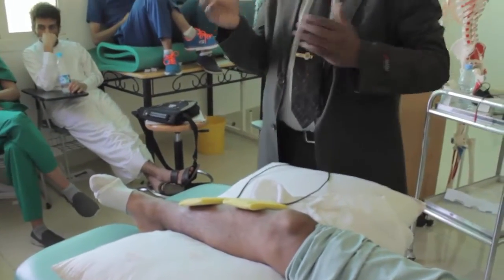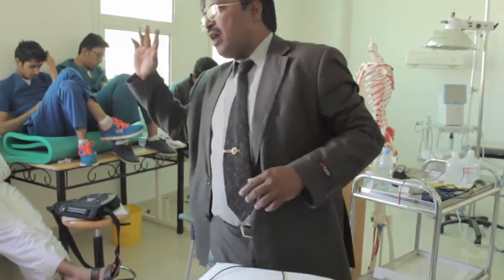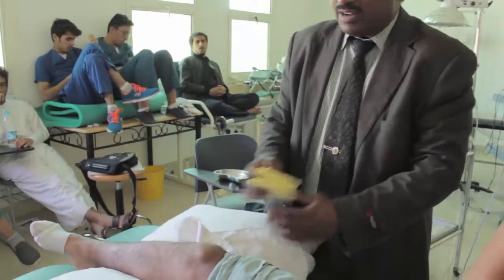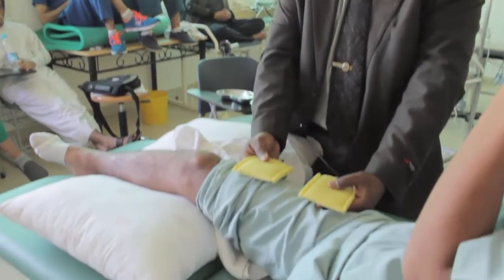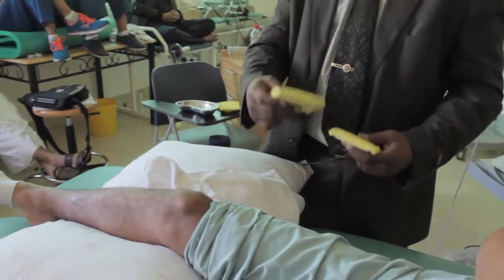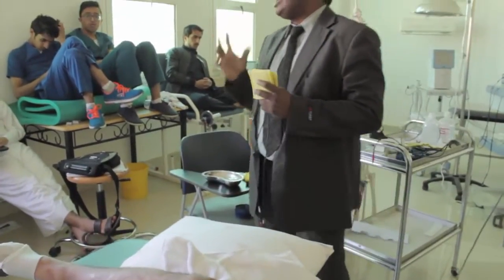If you want agonist and antagonist stimulation, then 2 electrodes should be on agonist like dorsiflexors, and opposite group plantar flexors, another 2 electrodes. Like flexors, extensors of the knee, same, agonist is extensor, antagonist is flexor. So 2 electrodes on each group of the muscles will stimulate the muscles and strengthen.